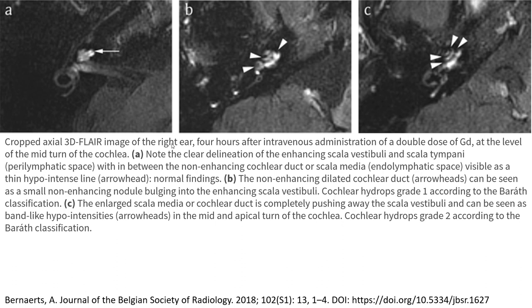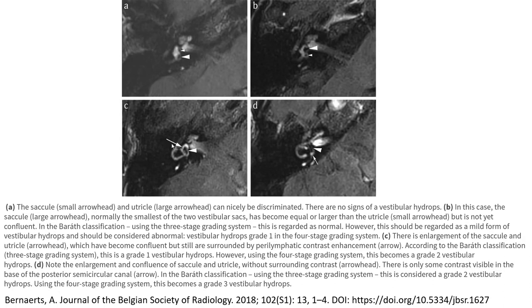In image C, the enlarged scala media of the cochlear duct is completely pushing away the scala vestibuli, and can be seen as a band-like hypointense structure, arrowhead indicated, in the mid and apical turn of the cochlea — cochlear hydrops grade 2 according to the BERAT classification.